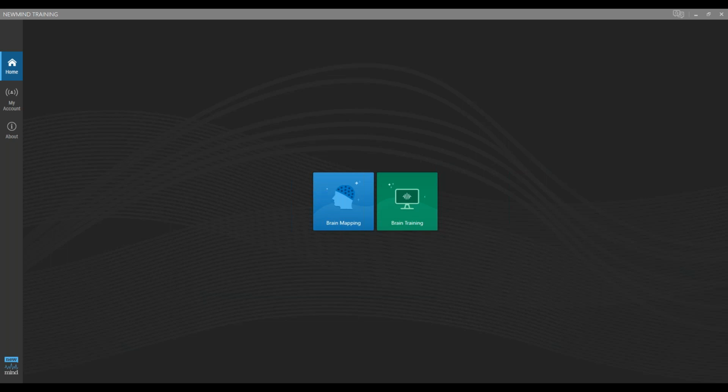Those can help reduce some of that interference before it actually gets into the computer. But just really cable separation, and don't have more electronics on in the room than what you necessarily need. Like Michael was saying, everything that he had plugged in was outputting a 60 hertz field. So just try to minimize what you put in your neurofeedback space. Especially, we talked about no backup battery supplies, and that can really help reduce any possible interference between other devices and the neurofeedback amplifier.